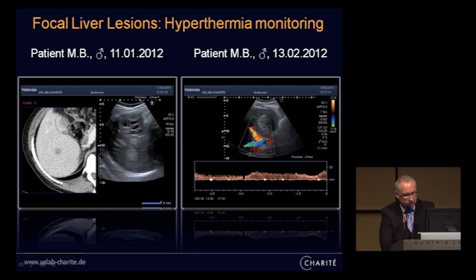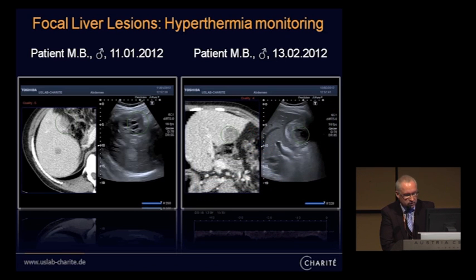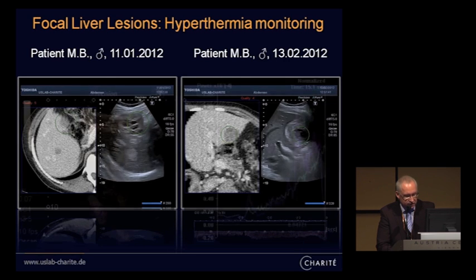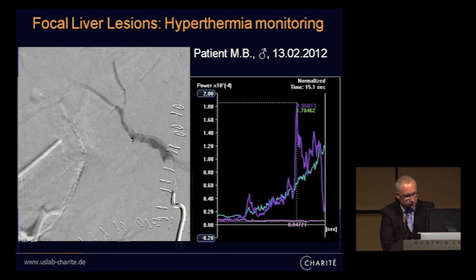And of course, we are in a good situation to have a good correlation to the CT scan. And we see once again a typical washout in the portal venous phase. So this is the setting before the therapy starts. This is immediately after therapy, and we see there's only a portal venous phase spectrum here. There's a problem after therapy because we have here an occlusion of the arteria hepatica, a big problem here. This is the situation in correlation CT and ultrasound once again. Look at these images, better resolution on ultrasound, of course. And this is the beneficial value of ultrasound. We see a complete absence of signal here in the metastasis, completely treated. We see a signal in the liver tissue as well in the portal venous phase.